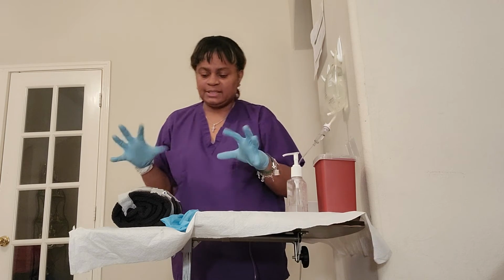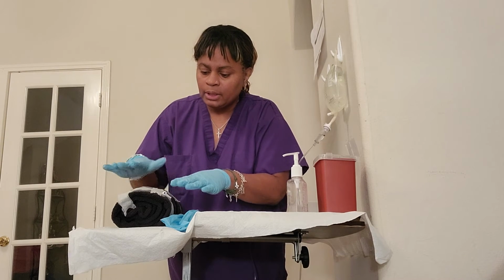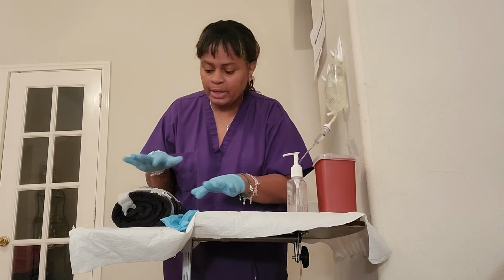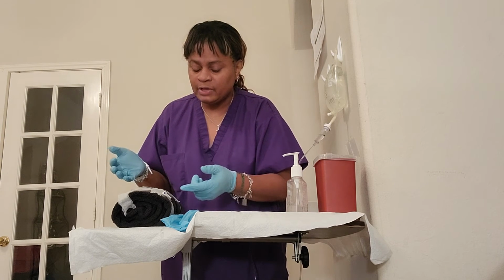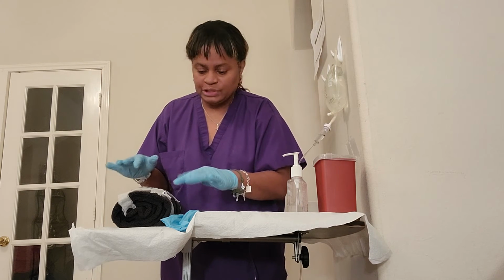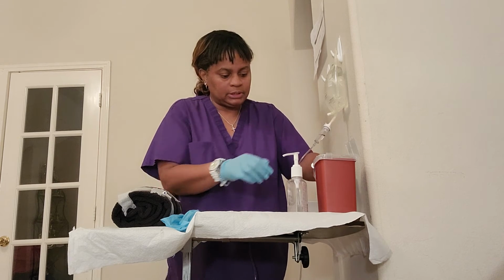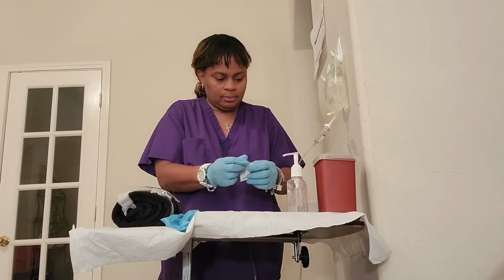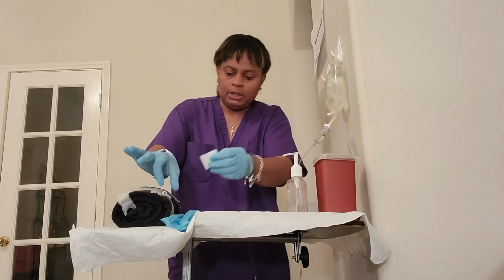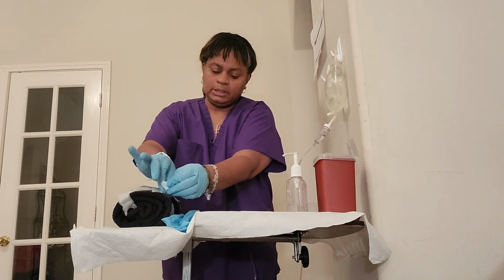Now I'm going to assess the site that the fluids will be going to. I'm assessing her site, and are you having any pain? Okay, there's no redness, no swelling, no infiltration, no sign of any type of infection or discharge. Okay, so what I'm going to do now is I'm going to get an alcohol prep pad, and I'm going to grab the hub here and clean it.